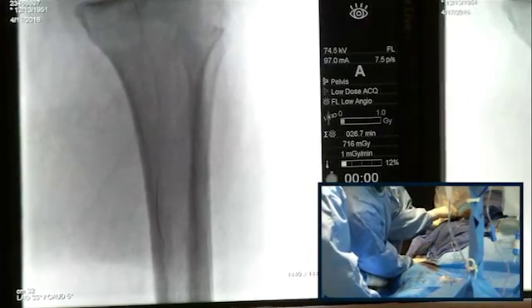Can you just describe what wires you're using too? Mehdi, can you describe the equipment, the catheter and the wire? This is a 018 CXI, and Pilot 200 with a 3.5 gram tip. Perfect. So as you can see now, I think we have crossed it. I think so too.